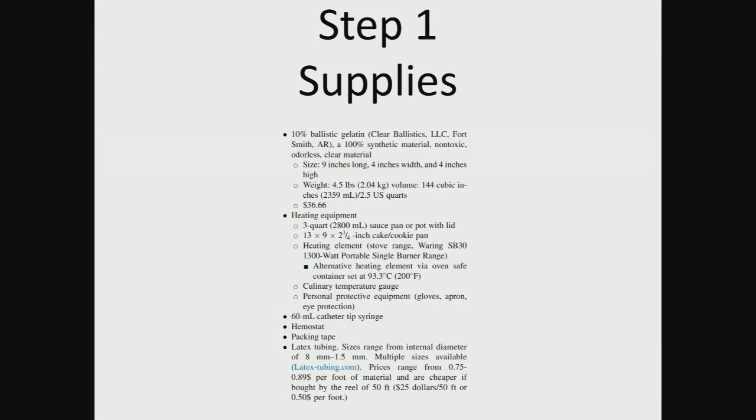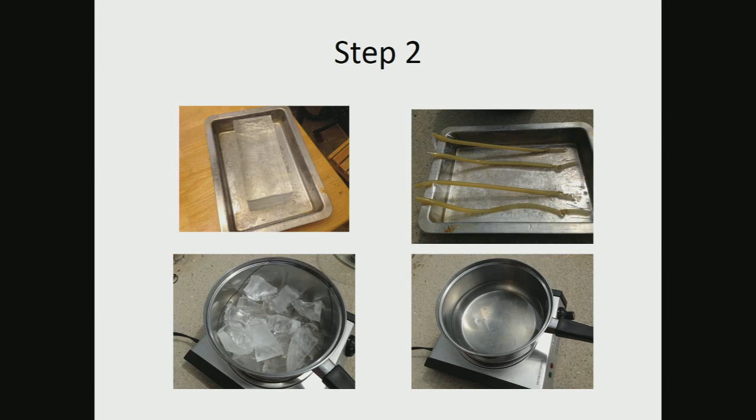There are recipes online for Ballistics Gel and companies that make it. We started with a company called Clear Ballistics. I liked that it was clear so users could look down after doing their ultrasound and see where the needle actually went — you could start seeing through the material. This is a detailed recipe how-to sheet. It takes about 30 minutes to make, and you can make about 20 at a time.